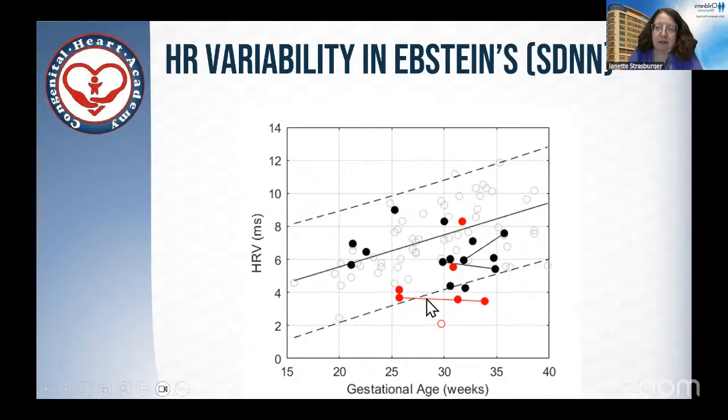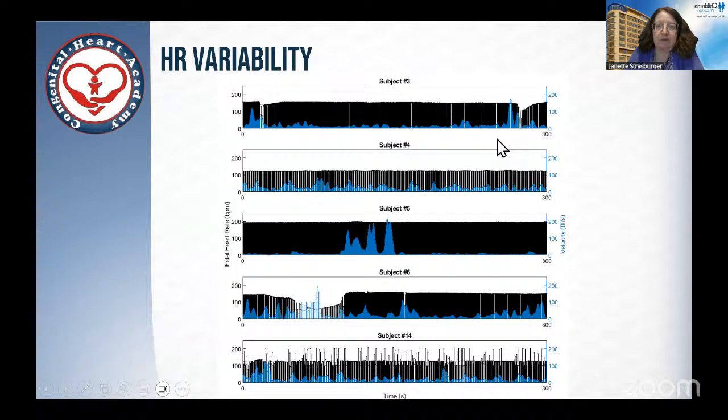But in the patients that died, we did not see any improvement in the heart rate variability over subsequent follow-up. And so it's not always present, but I'll show you just some examples here. This is an overlying image here. These are five minute heart rate trends. So this is 5 minutes worth of heart rates, in this case around 150.